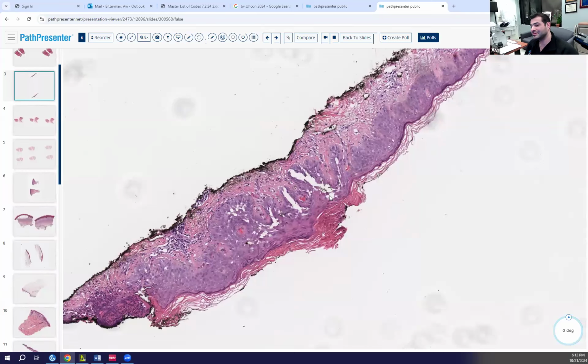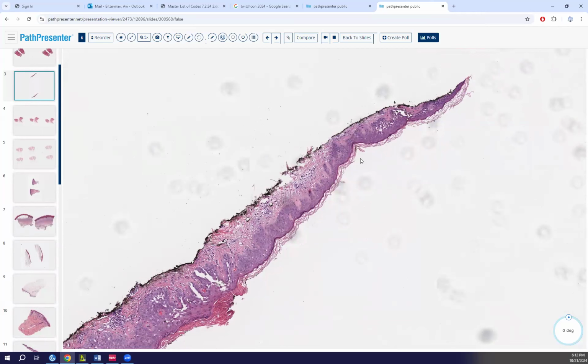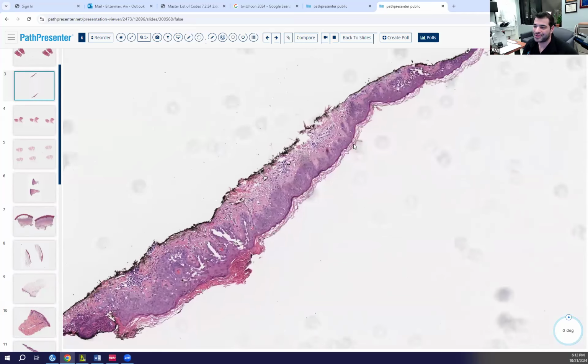Okay, Grover's. And then anything else? I forget what it was though. Darier definitely, but I feel like there's another one, warty dyskeratoma, that we mentioned recently. We mentioned Hailey-Hailey. Now we mentioned Darier. Grover's is mentioned. And there are some rarer ones. Those are the main ones you have to know. There are some others. But okay, what of those do we think this is?